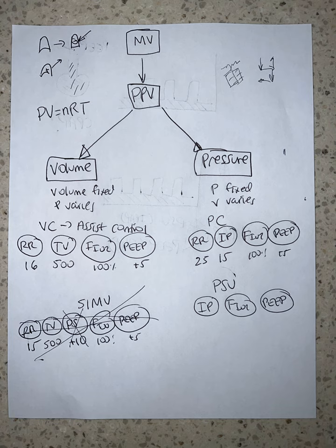But those are kind of the main principles of mechanical ventilation. So there's a question about, do we have physiologic PEEP? And the answer is, spontaneously breathing, no. That's all a manifestation and consequence of the artificial pushing of air into the lung by the ventilator, which is not natural and also can cause lung damage.